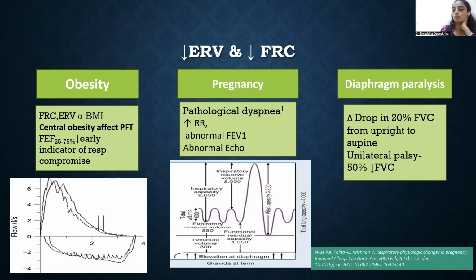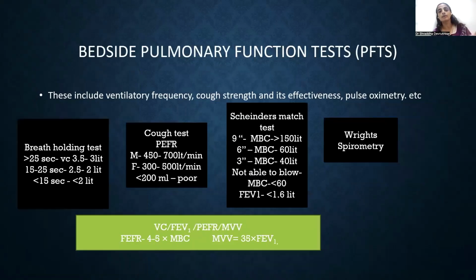And we should all know that if there is an obese patient and you're giving a block for a cervical spine patient, they need monitoring post-operatively as well. Again, bedside pulmonary function tests, as anesthesiologists, we are doing this first. And if we find some pathology in this, then we refer this patient for your conventional or proper PFT.